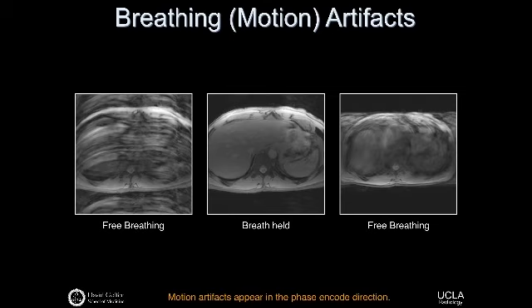So this is an example we talked about a little bit already. If we get a breath-held T1 weighted image here in the middle, maybe the image isn't your favorite image quality, but it's not so bad. If that same image were acquired with free breathing rather than during a breath hold, you'd get a very non-diagnostic image, right? So the entire time they're imaging, all of that spatial encoding business that we're doing gets really scrambled, and you have completely non-diagnostic imaging.